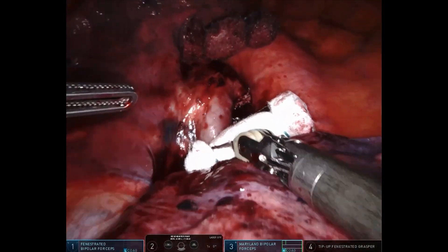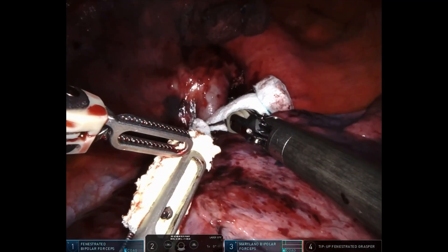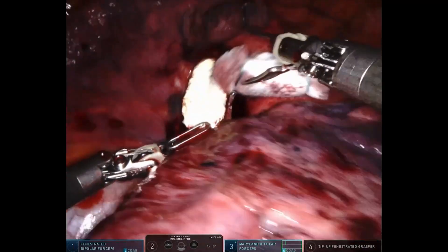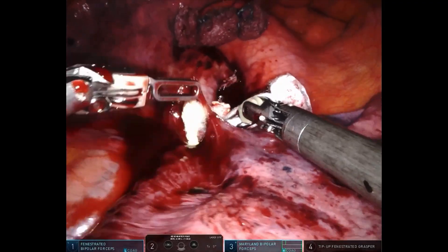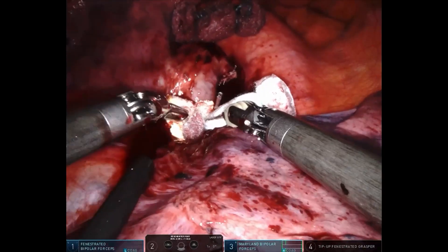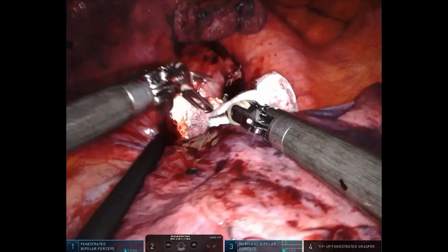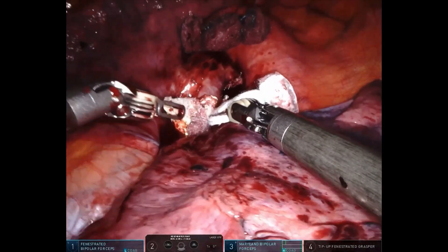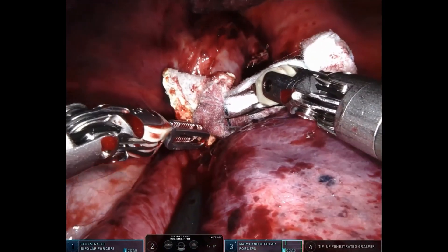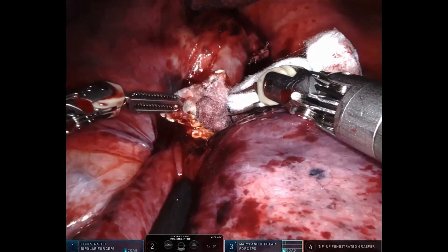We maintain direct compression while preparing the hemostatic patch with the other robotic arm. The gauze is swiftly removed and the patch is immediately applied over the bleeding site, followed by renewed compression with gauze on top of the patch. The goal is to ensure precise placement of the patch directly over the vascular injury and to maintain continuous pressure for 3 to 5 minutes. The gauze should not be overly wet to avoid displacement of the patch due to slippage; slightly drier gauze helps improve adherence and stability.